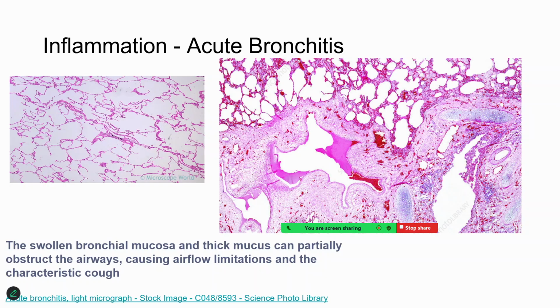And again, as I told you earlier, the pathology can be understood properly in the X-rays only if you have the idea of the actual pathology related to the disease as such. We will try to cover at least a few of the commonly seen disorders. Among them, the first is the inflammatory pathology.